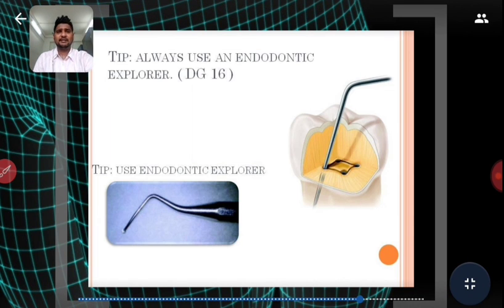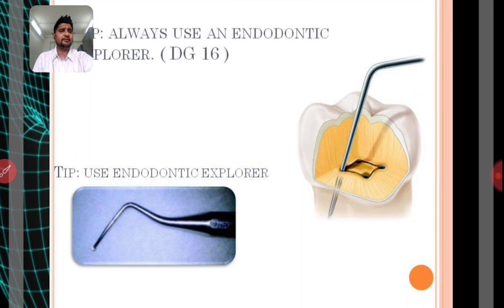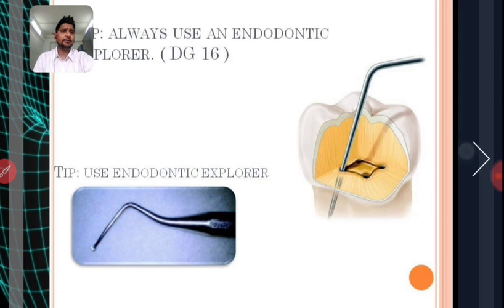You know, I must have done more than 4,000 or 4,500 or 5,000 root canals in the last 10 years. Every case I would use it. Every case I would use 3 burrs for opening, this, and then endodontic spoon excavator. Have it in the armamentarium. They are available with GDC, they are available with U3D, any company, whichever you prefer.